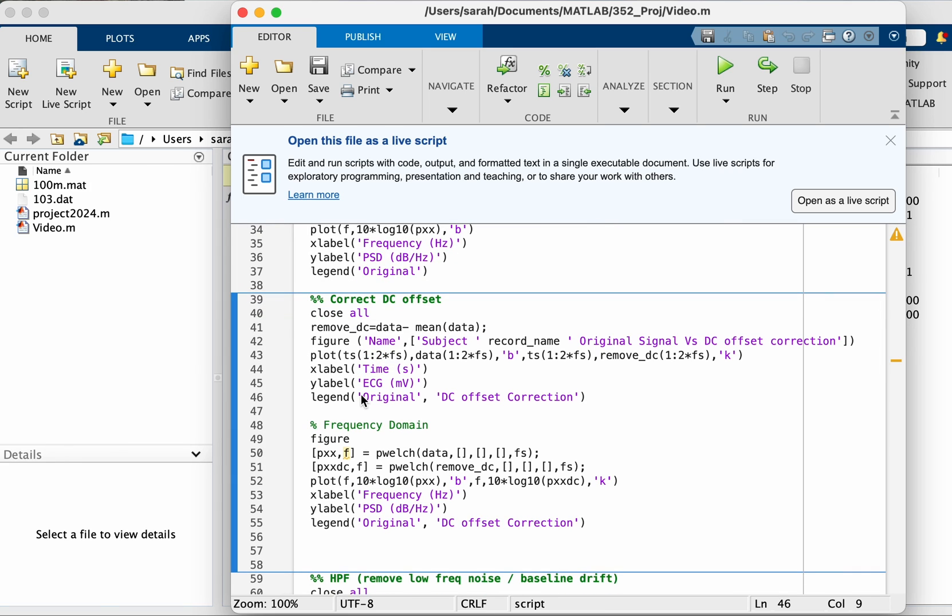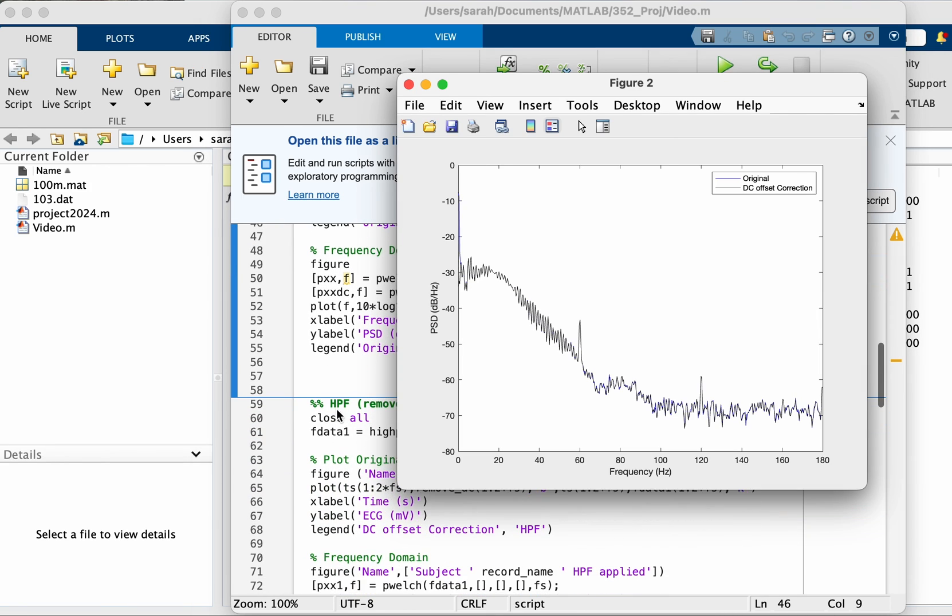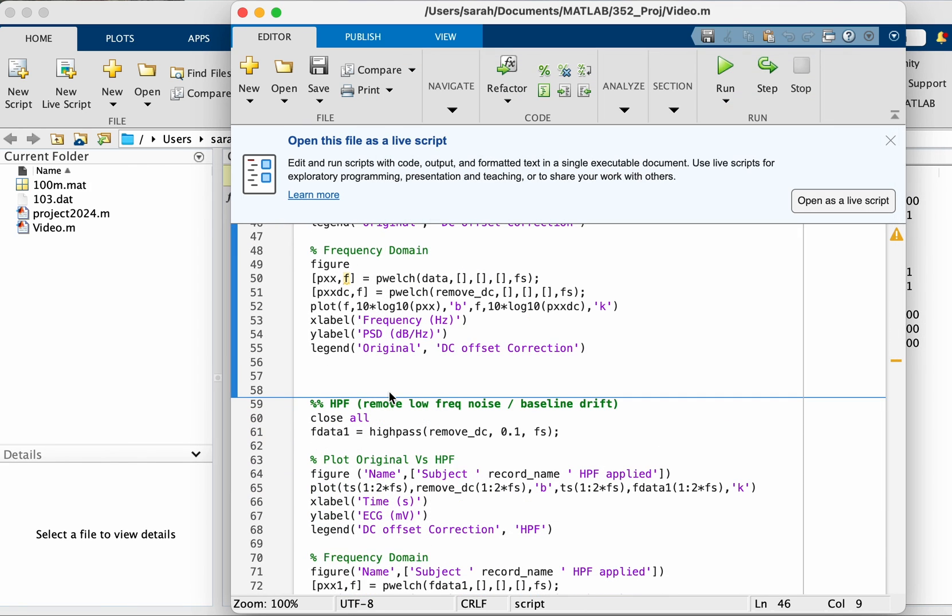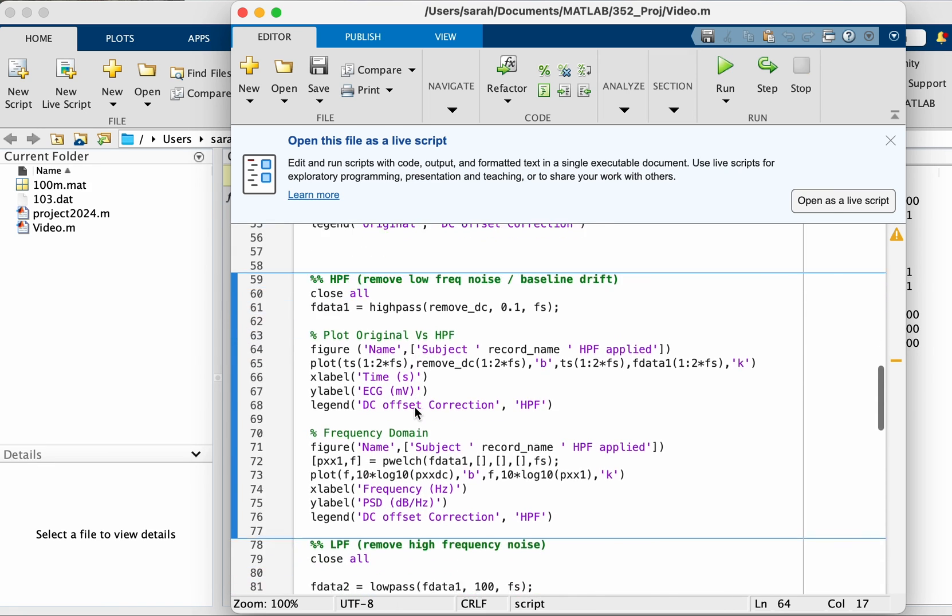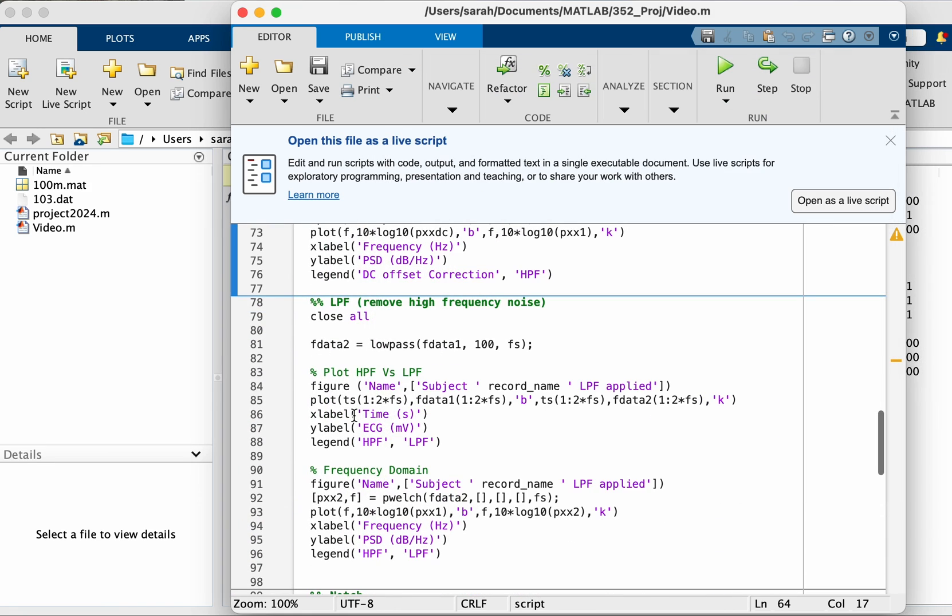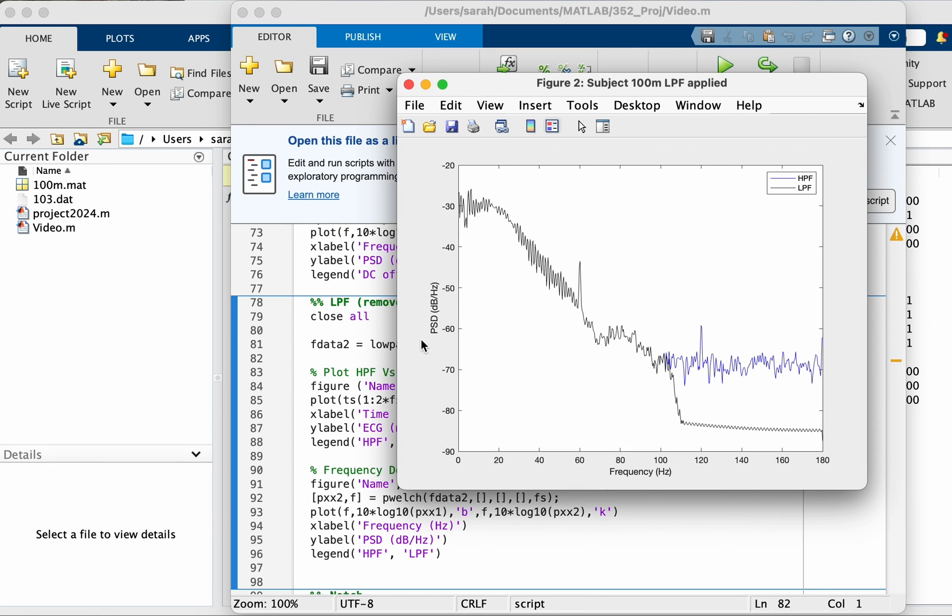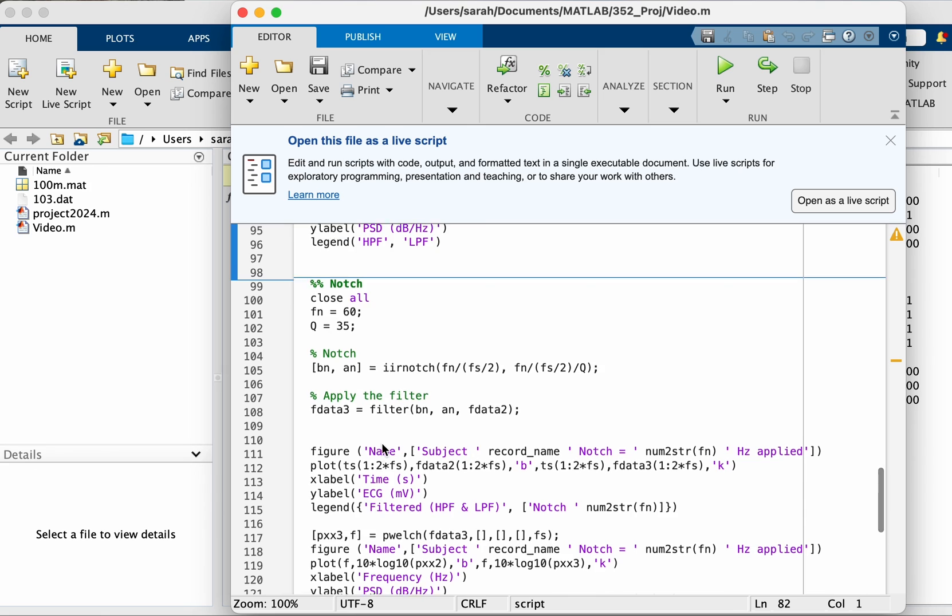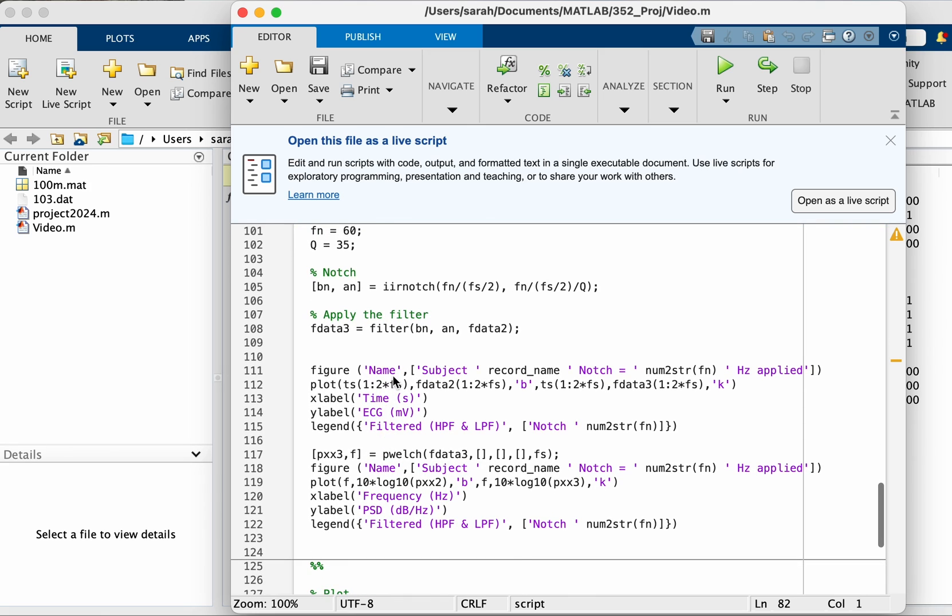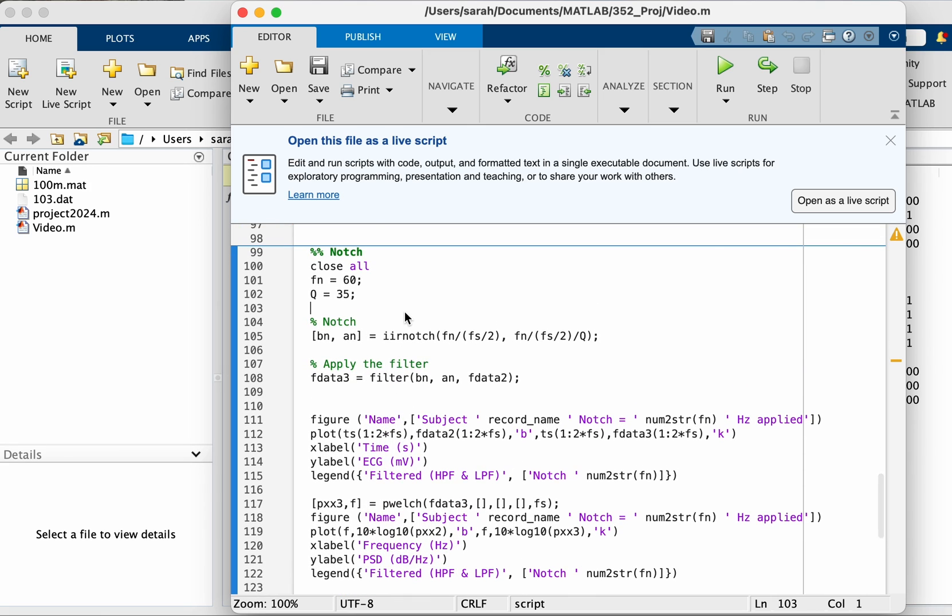So let's run first section, second section, and then correcting DC offset, and then taking the output of the correction, feeding it to a high pass filter, and then feeding the output of the high pass filter to the low pass filter, and then finally here the notch.